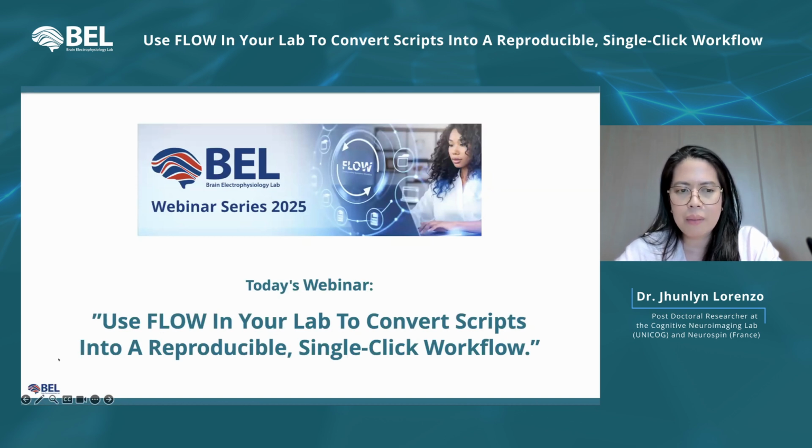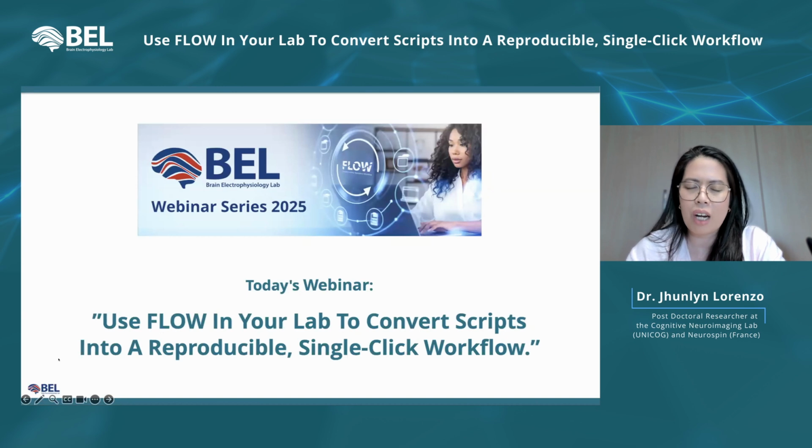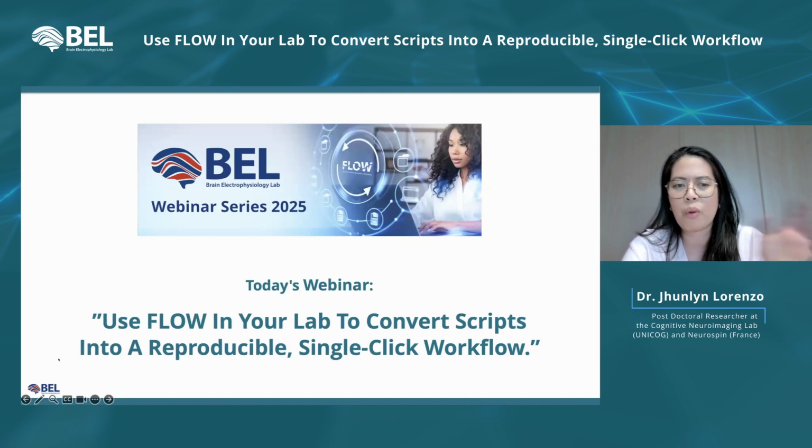For the second question, APICE is an automated pipeline, so we are working on the distribution of the voltages and also implementing adaptive thresholds. So there is no need to change the parameters. The default parameters that we are suggesting are already enough to do the preprocessing. Since we are working on adaptive thresholds, we don't need to change the parameters from one age group to another.